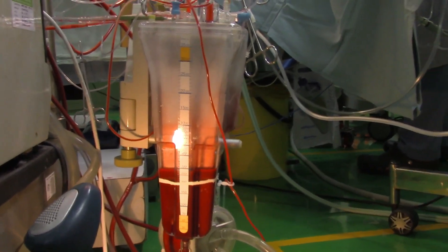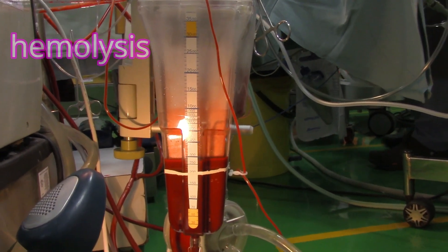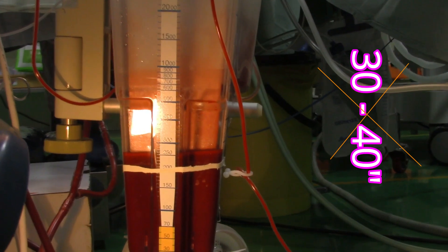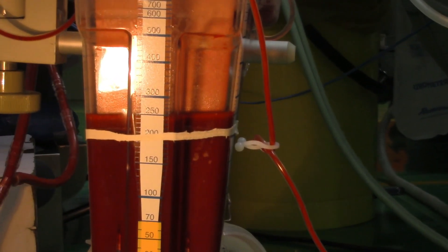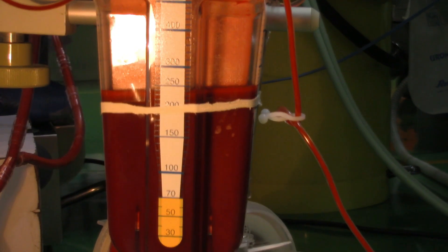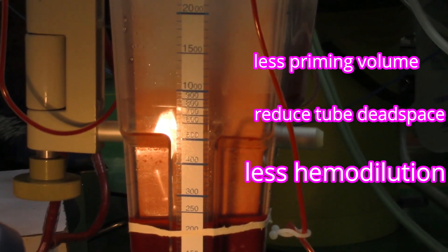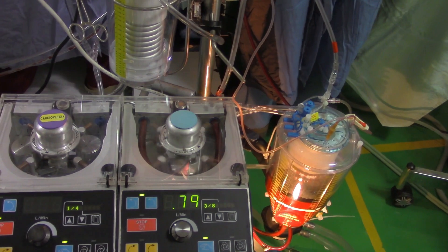The negative pressure can be increased to achieve the appropriate blood flow rate with minimum vacuum assistance whenever necessary. Excessive negative pressure should be avoided to minimize the risk of hemolysis and the chattering phenomenon, which may reduce venous return. Because vacuum is utilized for venous drainage, there is no reliance on height differential between the patient's heart and the venous reservoir. It is also possible to raise the height of the venous reservoir, shorten the venous and arterial lines, and decrease tubing diameter. There is a negative pressure threshold of minus 120 mmHg beyond which the relationship between negative pressure and blood damage becomes linear.